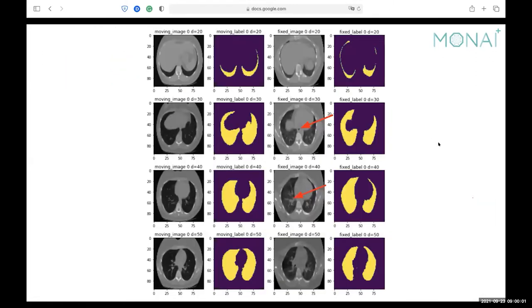Here is an example of our image inputs. The left two columns show the moving image and label, and the right two columns show the fixed image and label. You can see the moving image and fixed image are quite different — the red arrows point to locations where you can see typical structural differences between them. Our task is to find a deformation field to warp the moving image to make it more similar to the fixed image.